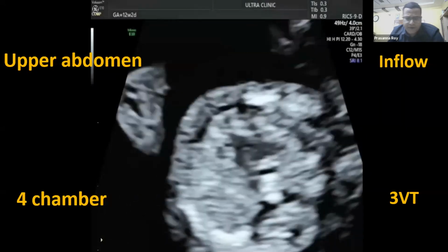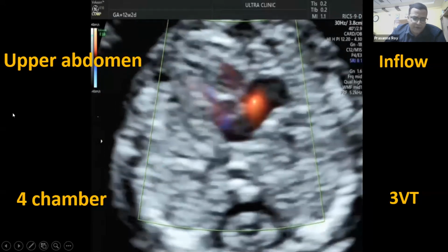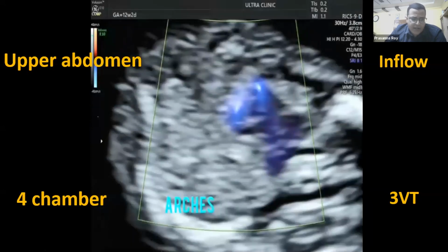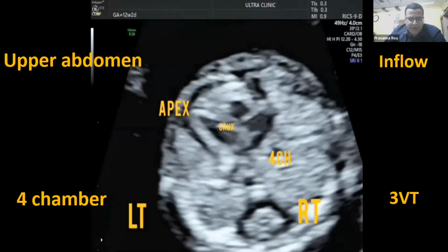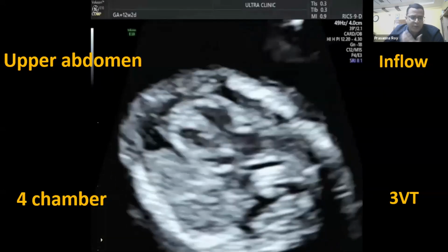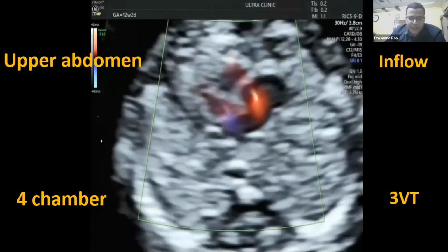So basically, in the first trimester, we are going to look at 4 levels of fetal thorax examination. Firstly, we look at the upper abdomen, that is, we look for the situs, whether the stomach and the aorta are on the left side and the IVC is on the right side. Then we move up to the 4 chambers. We will look for equality of the atria, the ventricles, the crux, the offset, the moderator band, and the most important part is switching on the color or the power Doppler to look for equal inflows separate from each other, not very close to each other.